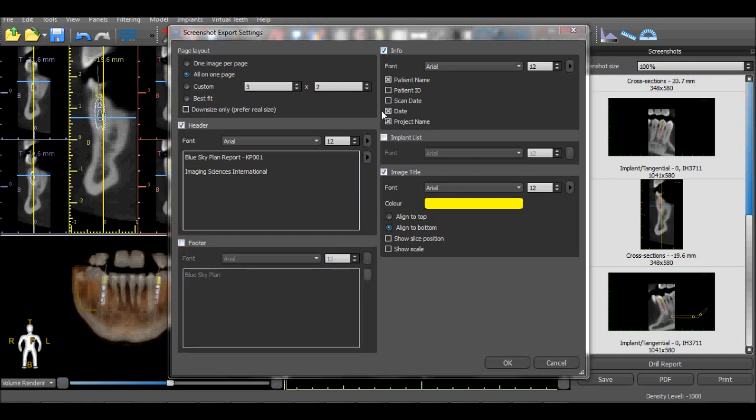In the Info section, the user can define which patient and project information should be included in the report. The implant list will display the placed implants in the treatment plan, and the option of displaying the image title will include the scale and slice position information.